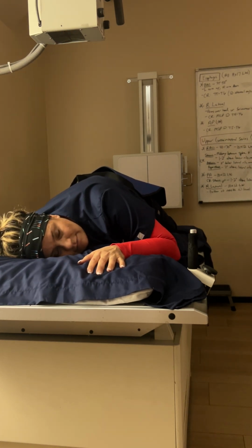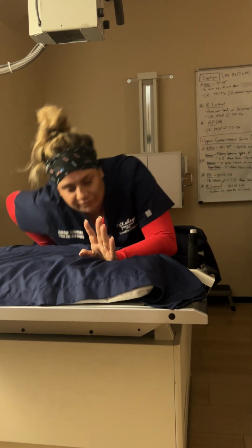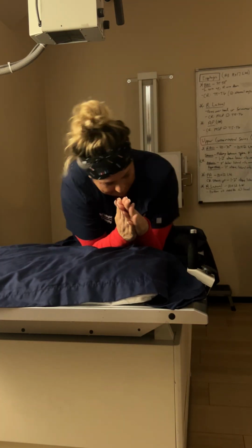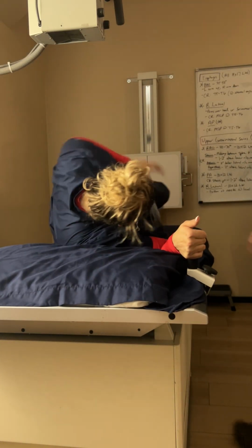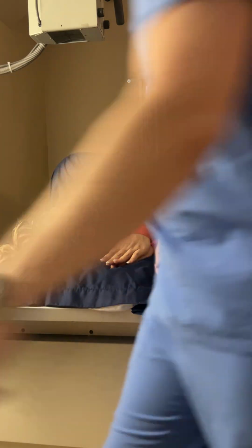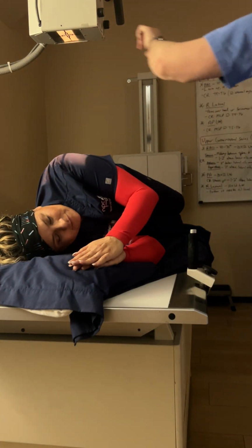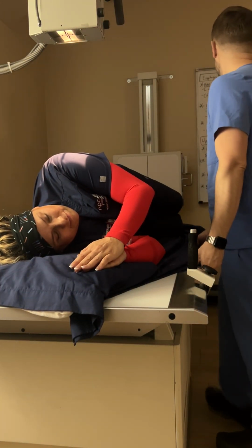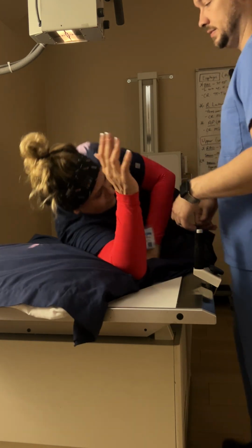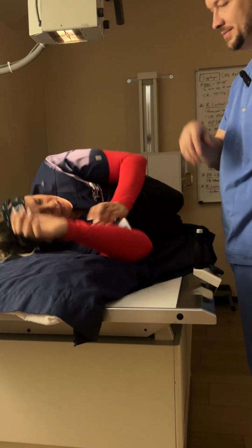Okay. Now we're going to do right lateral. So April, lay all the way on your right side. Where do you want my right arm? You can bring them both in front of you, okay? I don't fall. Arms over the head, or they could be in a swimmer's position too, if that would help with the drinking. But usually, you can have both arms up, yeah.